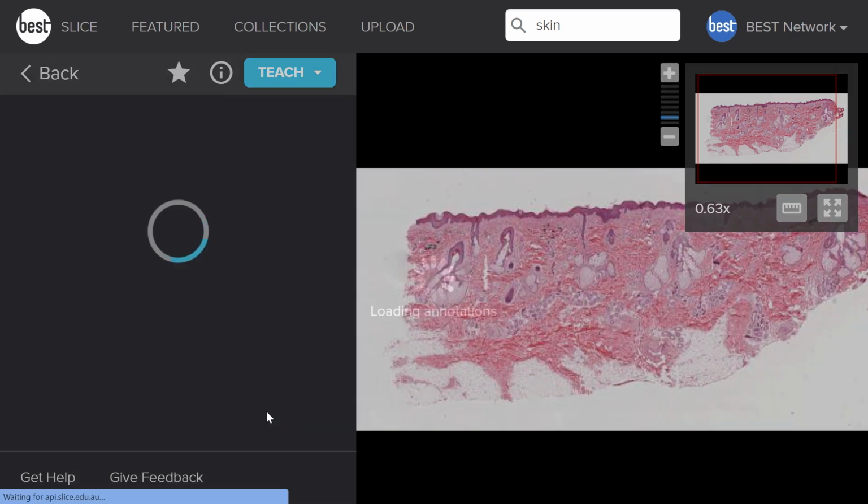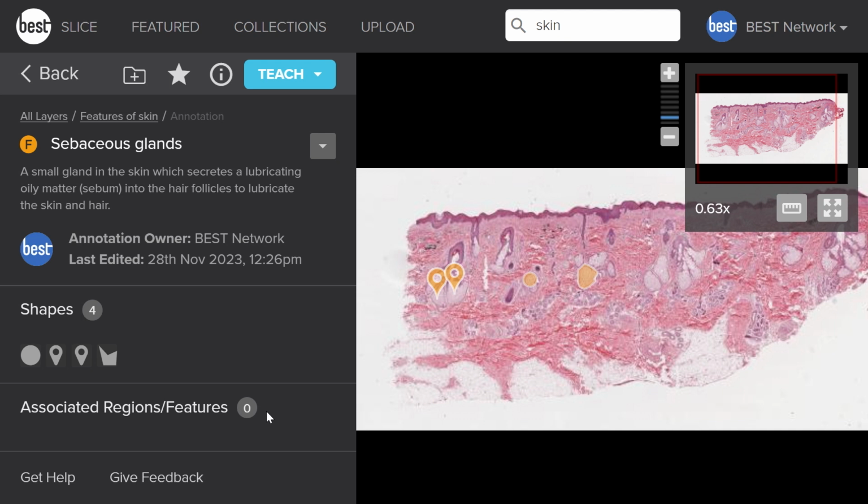So students are able to do this while their tutors are discussing the slide with them, pointing out the features, and on their own devices, in their own accounts, students mark out these features to create their own personal notes, or academics can do this either in the session or before the session to have a shareable set of notes.